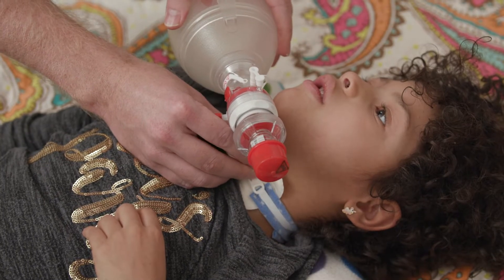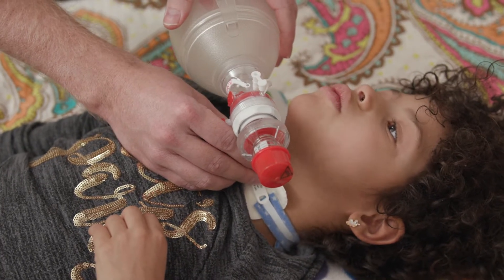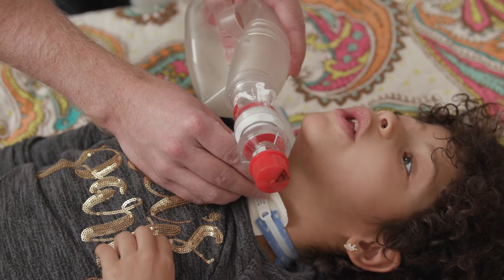There may be times in which you will need to manually ventilate your child. To do so, you will need a self-inflating resuscitation bag. Oxygen is not required but should be used when available.